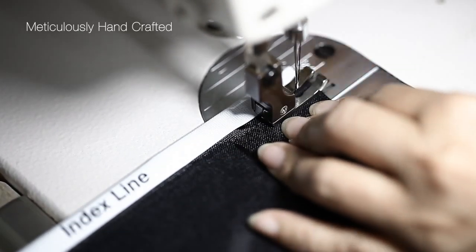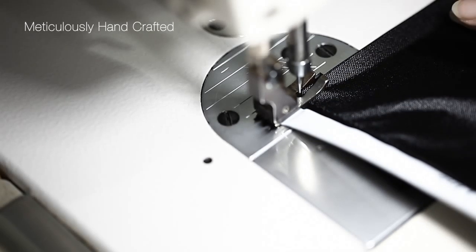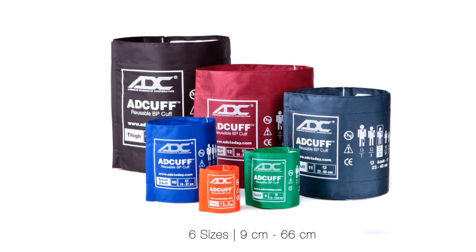The Adcuff is made from soft, comfortable, patient-friendly 210 denier nylon and sewn with shrink-resistant nylon thread to ensure it can handle repeated cleaning.